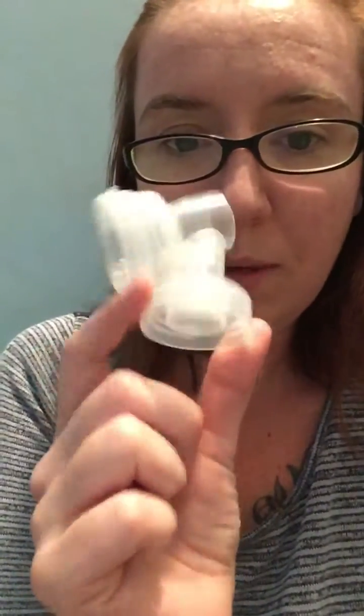And then there's this plastic part here, which is what connects the breast shield and the bottle together. Okay? And this has a little yellow valve inside of it. I'm going to take it off. One second. Ugh, it's not coming off. Sorry about that. Okay.